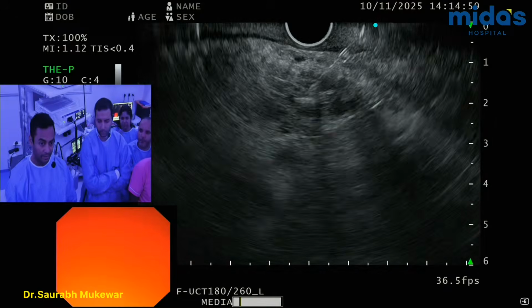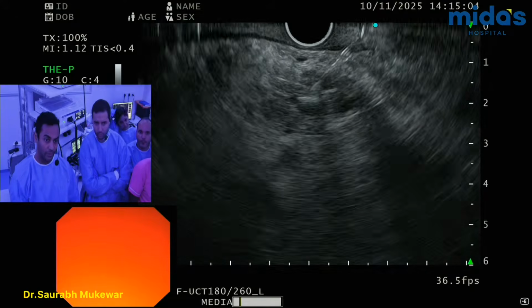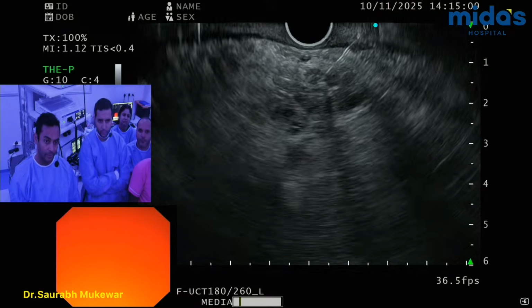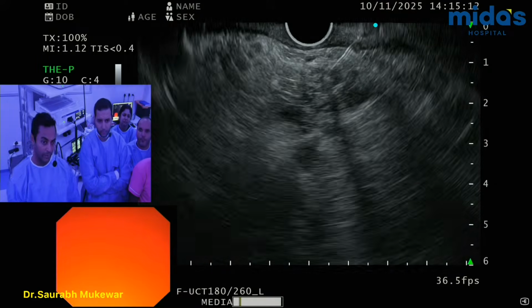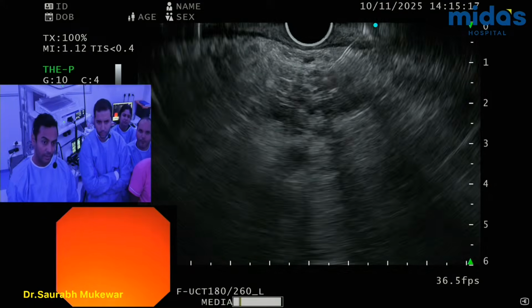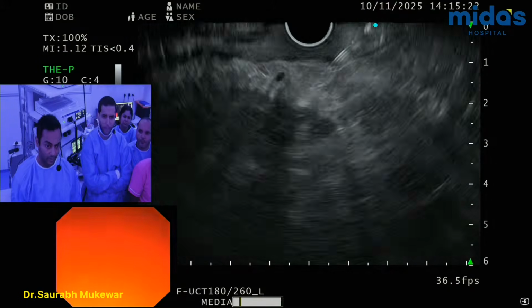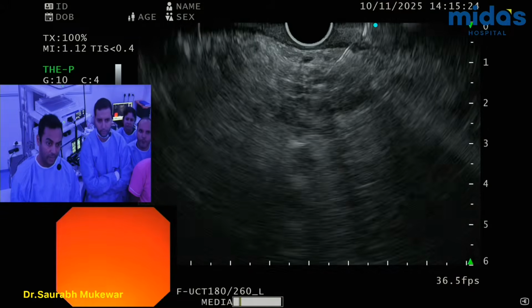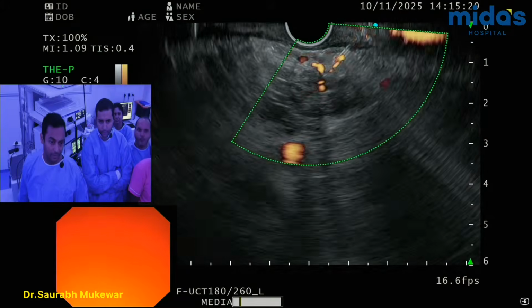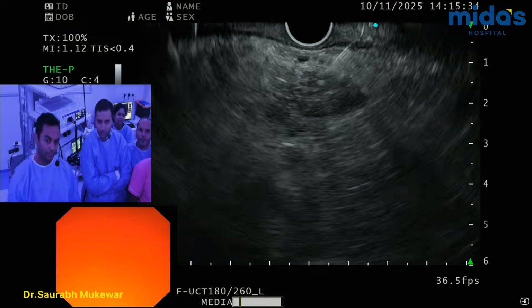All right, so there you go. That's the needle tip. Now it's at the edge of the lesion. So the first thing you do is pull it up gradually. Slow pull, and then you want to be in the proximal part of the lesion, right? So there you go, now in the proximal part of the lesion. And then I'm going to go in, and it's going through some septations, so you have to do these jabs. Now I also hit a vessel, I think. You see, there's a little bit of bleeding that's taken place, but that's okay. That much is fine because of the vessel below there.